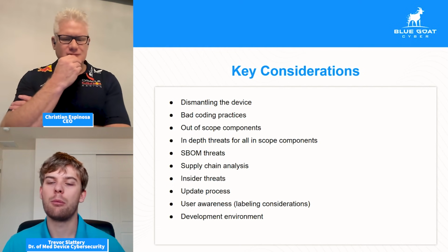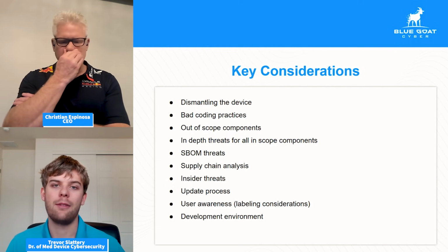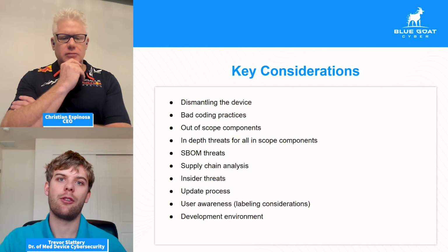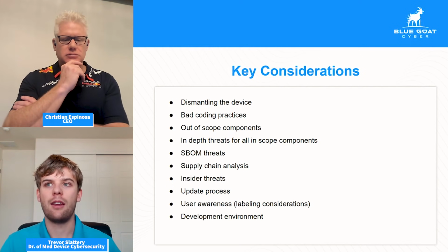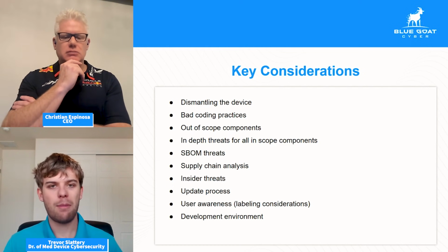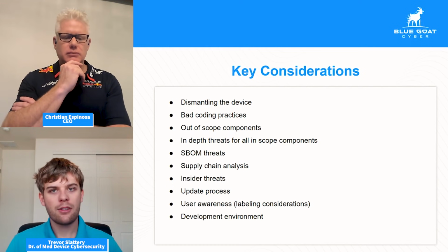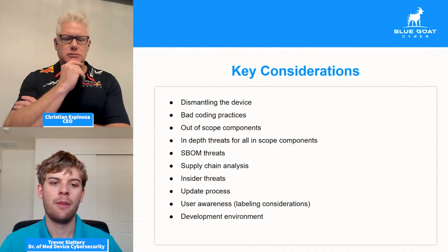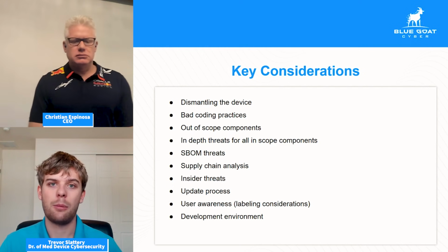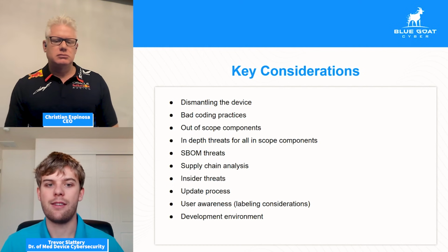So this is where proper risk analysis comes into the threat. We have to understand, what is the exploitability factor for this? Exploitability factor being essentially, how easy is it to execute this attack? What is the impact if successful? Is it possible to harm the patient? What can we do here? For any problem identified in the SBOM or identified in the supply chain, we want to have all of these considerations.